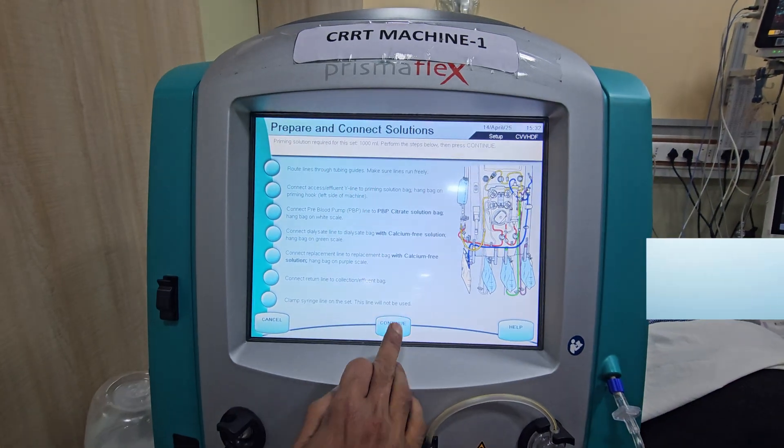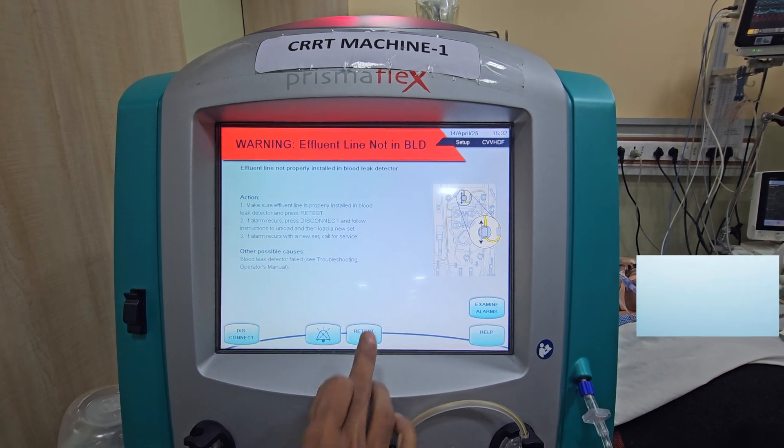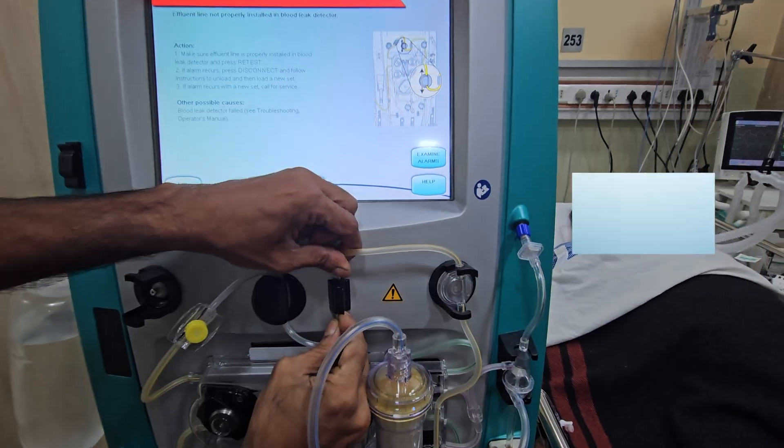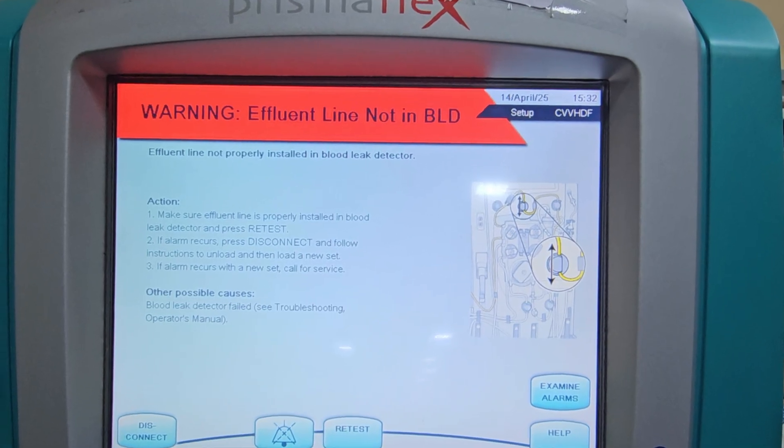Press Continue. Prime plus test initiated. If there is any block or kink in the circuit, a machine alarm will come and it will show the site of the problem.